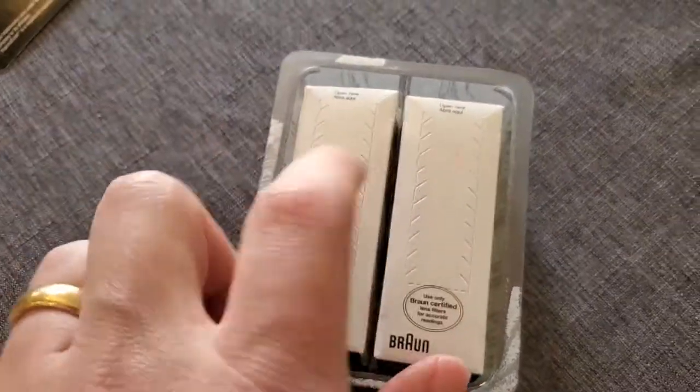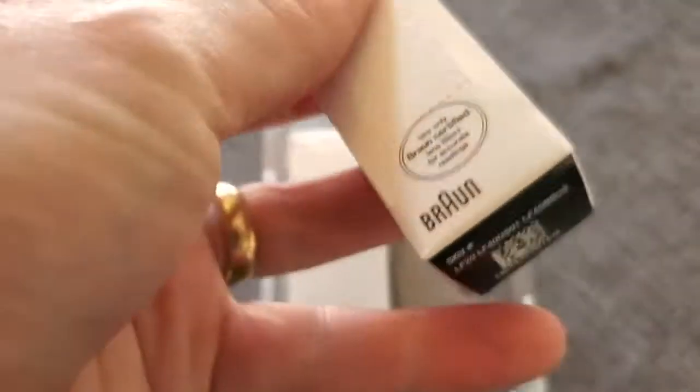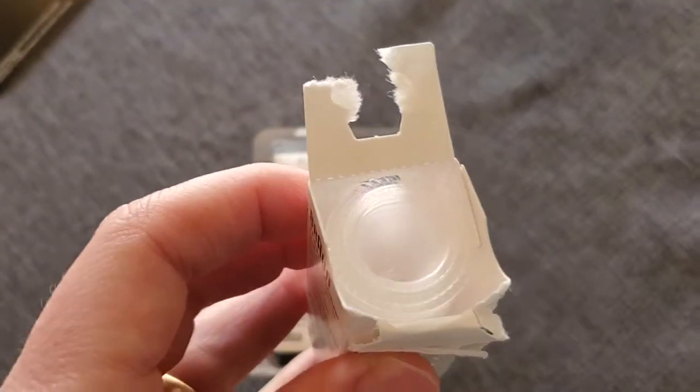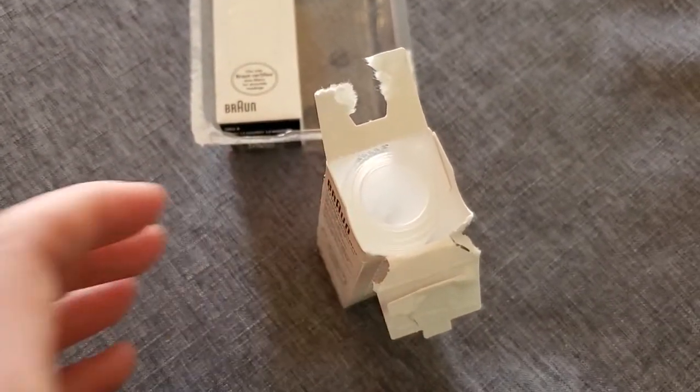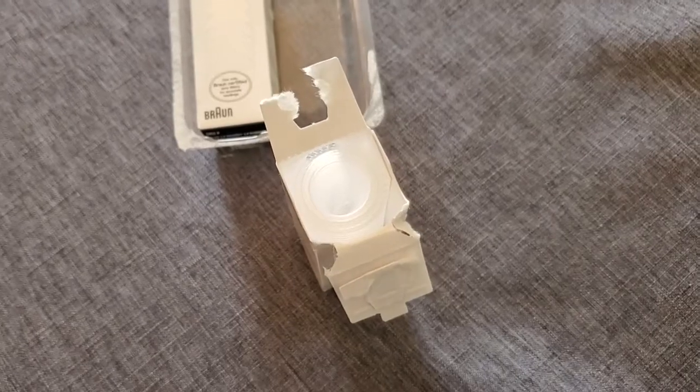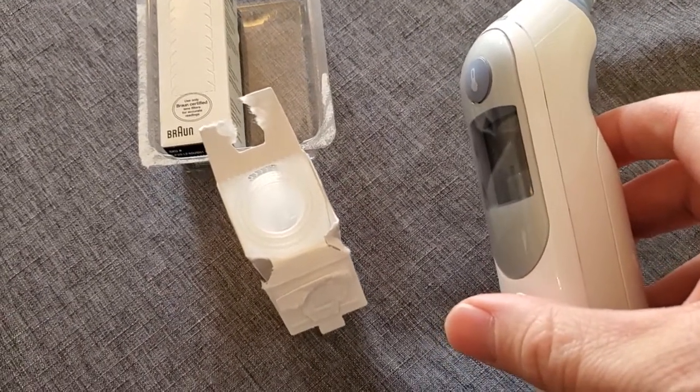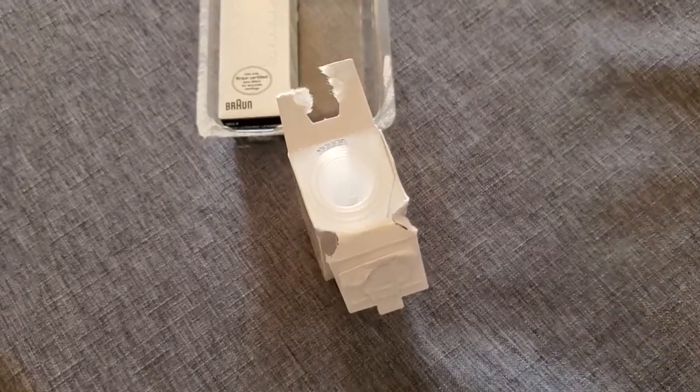In the box here we're getting two sets of these. I'm going to go ahead and take one of them out. The first thing you want to do is just open up the side — see where it says 'open' here. You can just keep this box in your cabinet, or sometimes these actually come with a little holder that you can put this box of covers into.